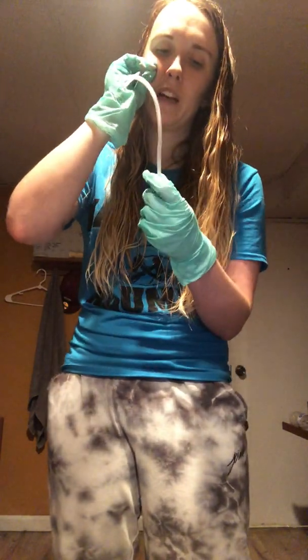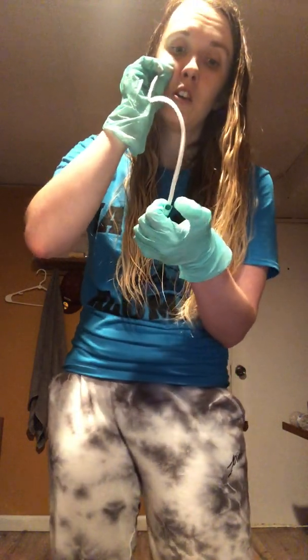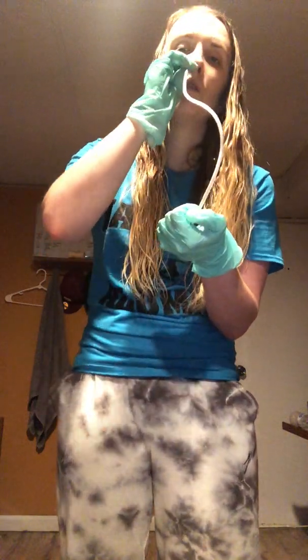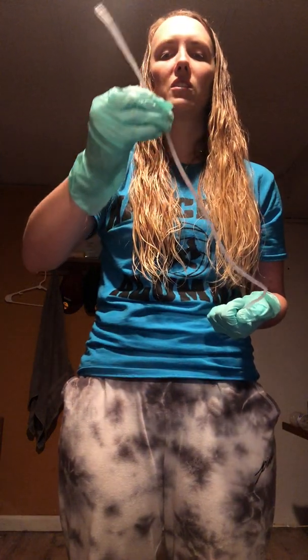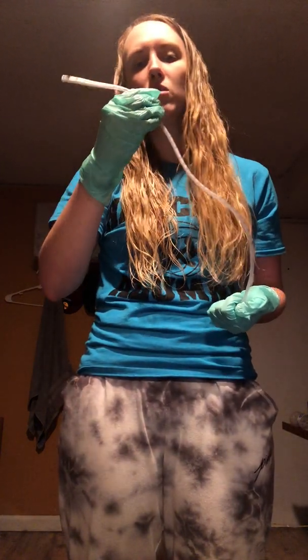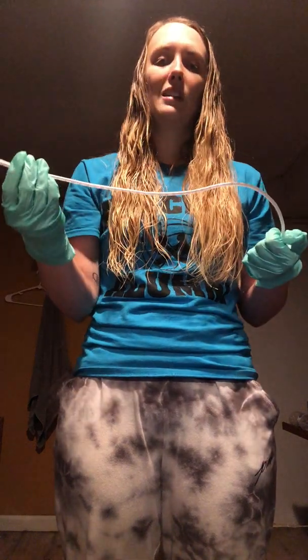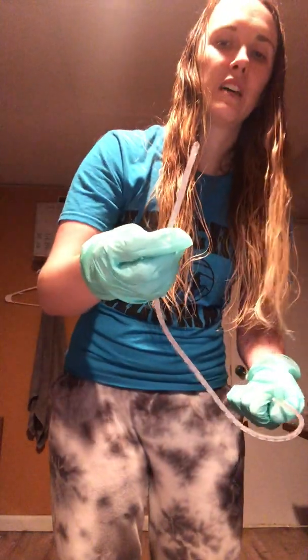Once we keep advancing this and get to where we marked, we're going to apply our suctioning when we are removing this. So I'm going to place my hand over the end of this and pull out, and we're going to rotate this tubing. This ensures that there's not going to be any trauma to the nose. Once we've removed that, we need to suction again, clear this out, and suction a little bit of our sterile water again.